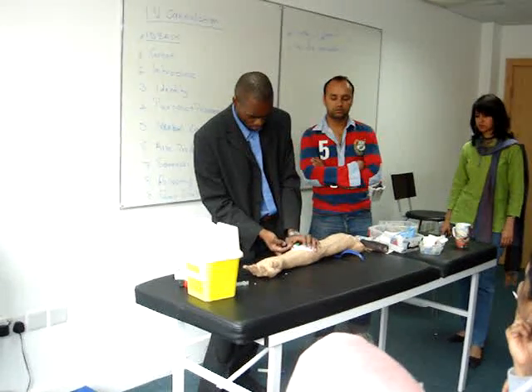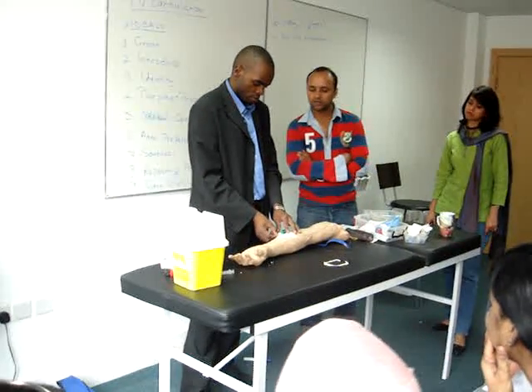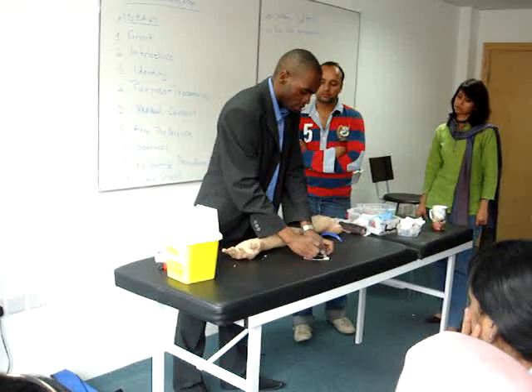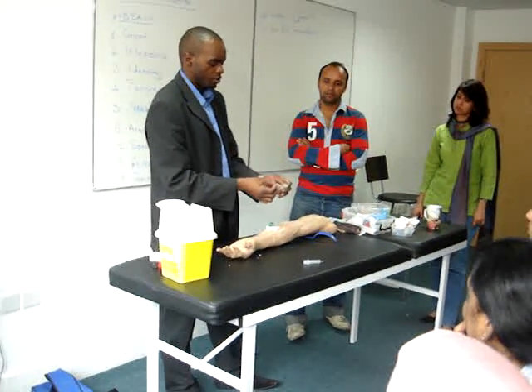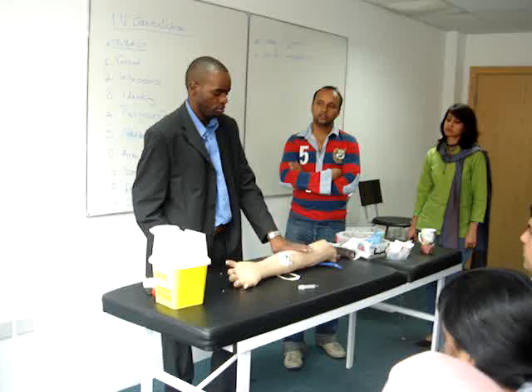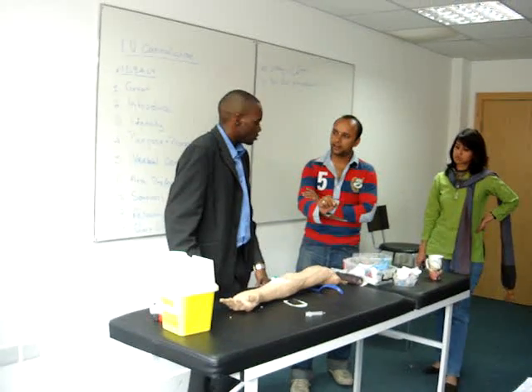Do you want to do this? Now you can see. We want to do this — look at this. The cannula has to go to the floor. So this part is going to be clear, transparent. You can see any information — if there is any thrombosis or anything — from the color. You need to actually write in the name and date.